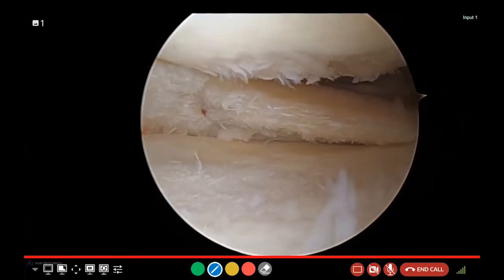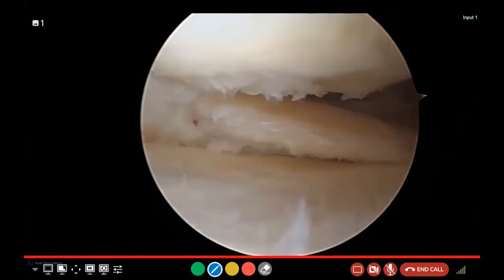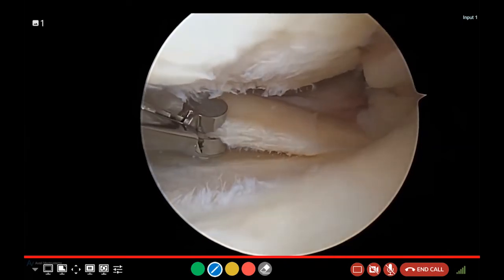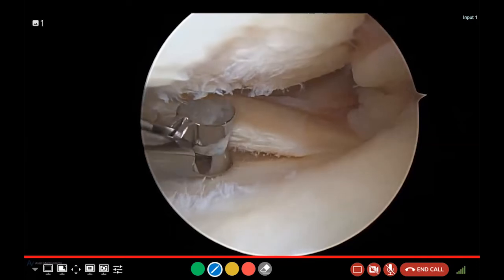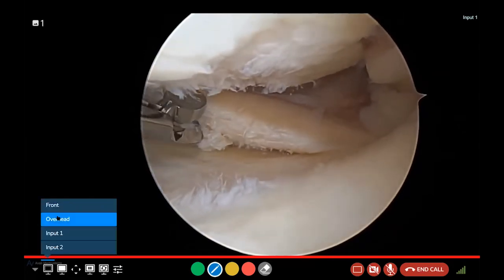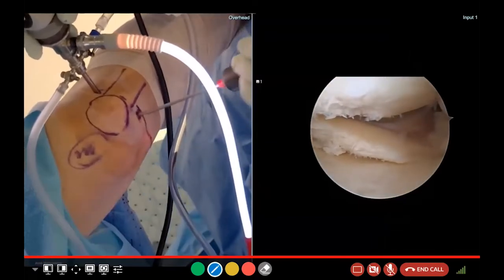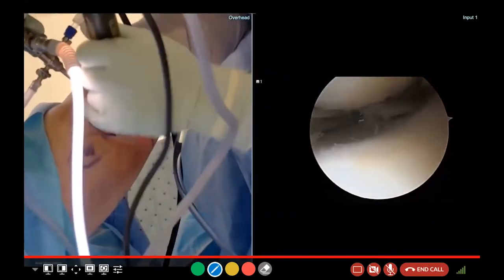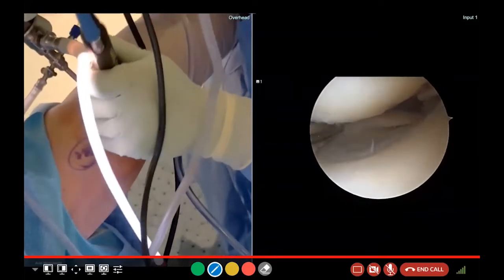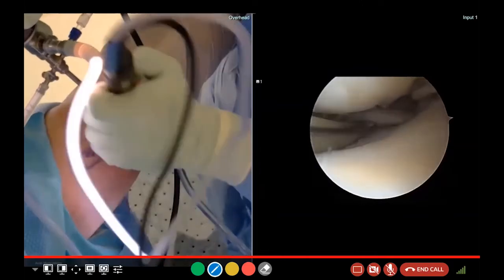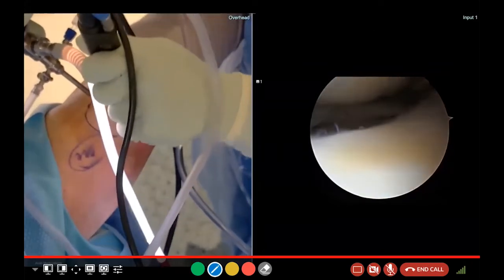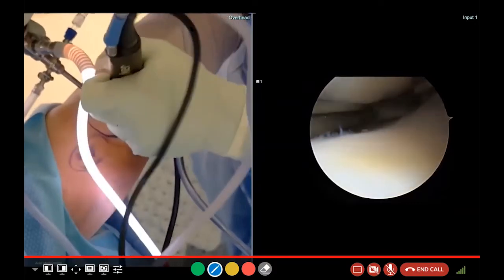You can see I'm just working back the meniscus — I want to remove all the torn portion while saving as much of it as I can. A lot of times the question comes up: when you smooth out the cartilage damage, aren't you removing more cartilage — aren't you making the arthritis worse? And that's actually true. We're trying to take away the mechanical problems of the torn tissue, but I'm trying to be careful and leave as much of this meniscus as possible, because the meniscus is a cushion that protects the cartilage.